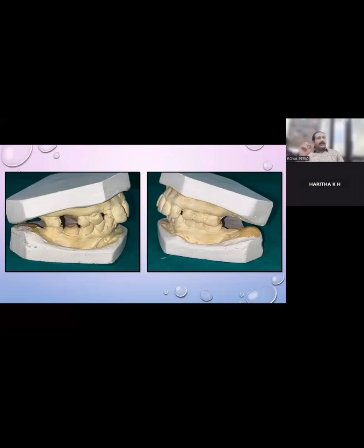There comes the lance drill. So the lance drill should be started from there. And the purpose of the lance drill is to know the angulation and position. Yeah, exactly, the position and the angulation. So you can go maybe up till how many millimeters into it? 3 or 4. At 6.5, you will encounter the sinus floor. So the maximum possible is 5. 4 or 5 millimeter you can enter into that crestal bone.